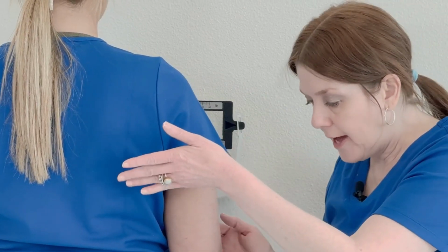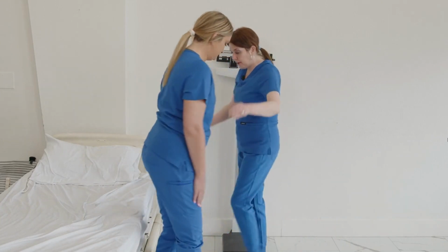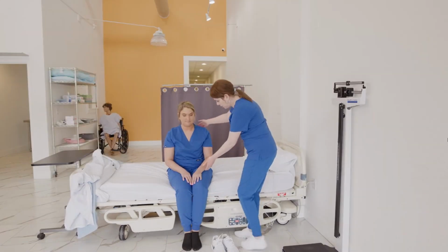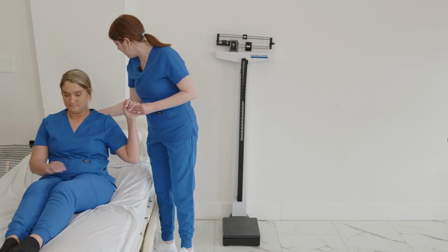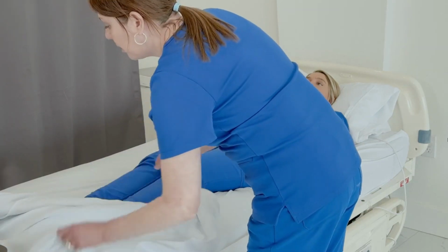Miss Megan, I'm going to go ahead and have you step off the scale. I'm going to bring you back to bed. Go ahead and sit down for me. Take your shoes back off. I'm going to assist you back into bed. We're going to have you lay back down. And I'm going to cover her up.